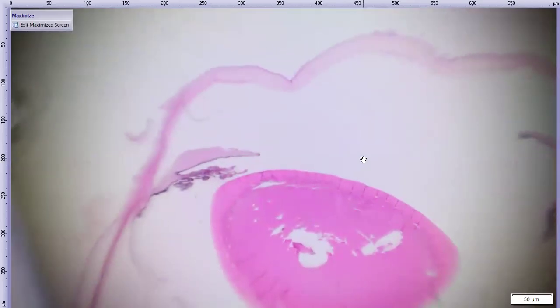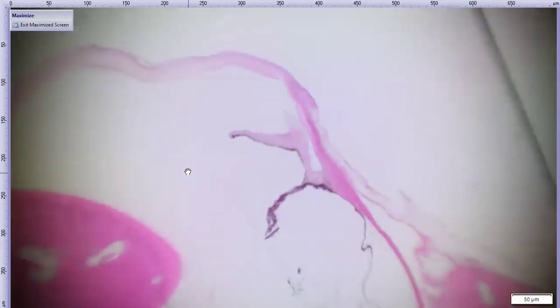The limbus is up here, but the iris base is way down here. And the ciliary body plicae essentially look like they're coming off the base of the iris, which is a little unusual. So the iris and ciliary body are distorted relative to one another. Over here, there's even more distortion. The iris looks like it's trying to be a balloon animal or something. We've got a little face here, a little front leg. But in any case, very severely distorted.